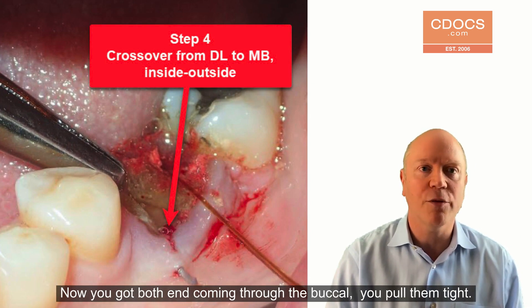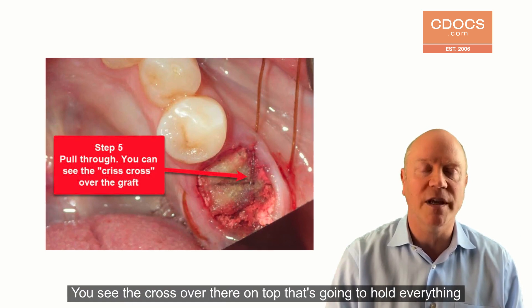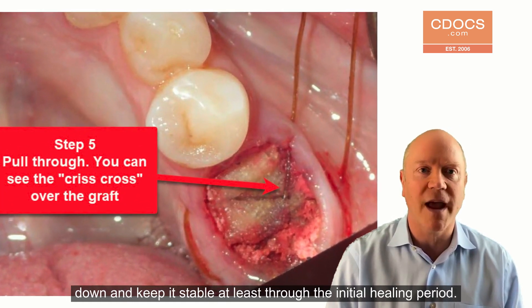Now you've got both ends coming through the buccal. You pull them tight — you see the crossover there on top. So that's going to hold everything down and keep it stable, at least through the initial healing period.